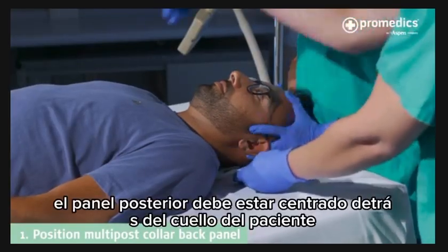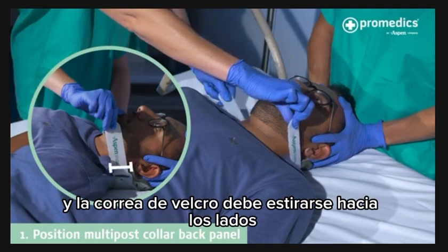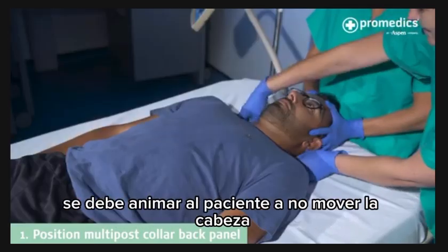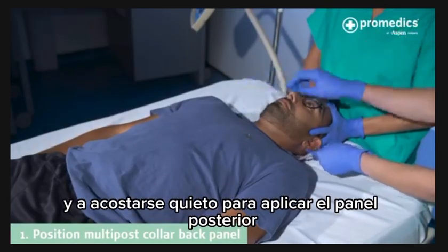The back panel should be centered behind the patient's neck, and the Velcro strap should be pulled out to the sides and aligned at the midpoint between the patient's earlobe and the top of the trapezius muscle. The patient should be encouraged not to move their head and to lie still.